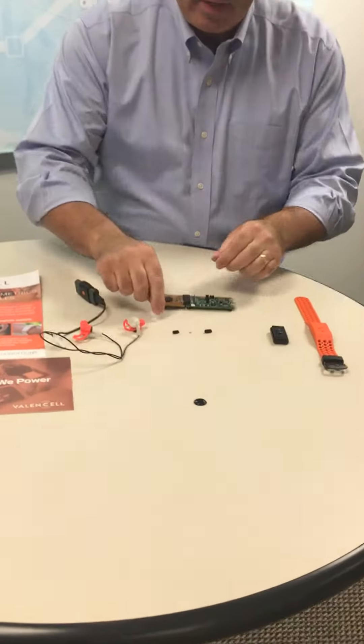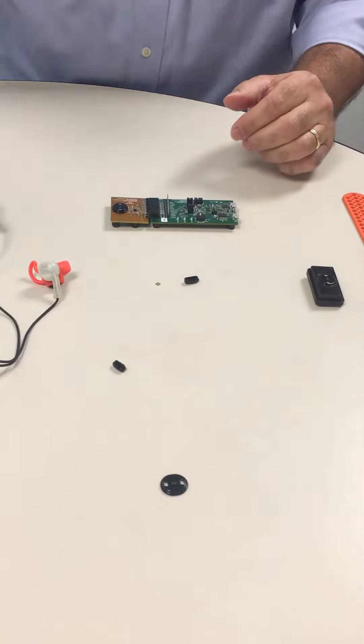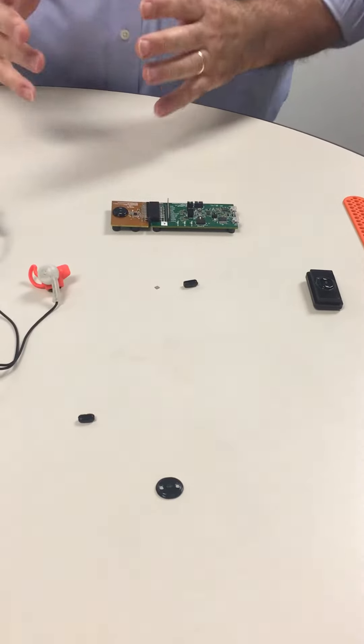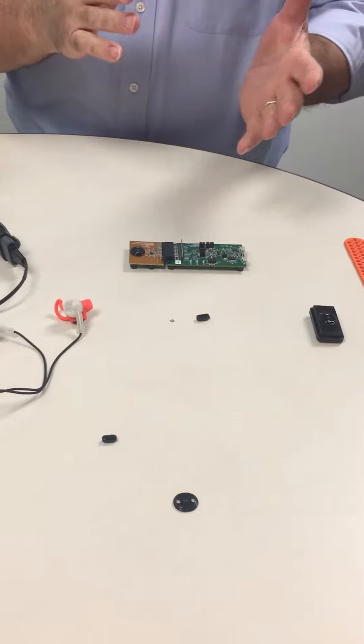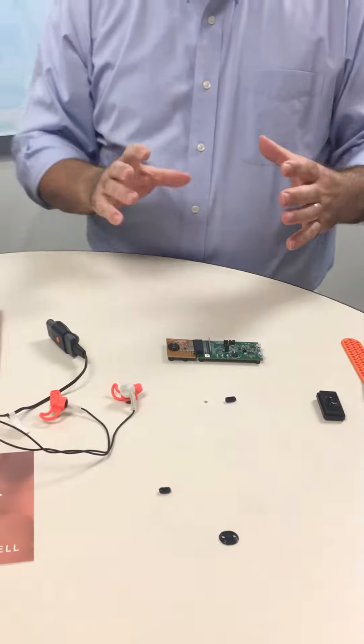We have two basic form factors for benchmark sensors. We have one for the wrist or the body, which we can see here, that we call benchmark wrist, and we have one for the ear that's a little bit smaller and goes in the lower concha of your ear. Our sensors include everything from the optics, the accelerometer, the LEDs, the detector, and the microcontroller that does all the signal processing for you.